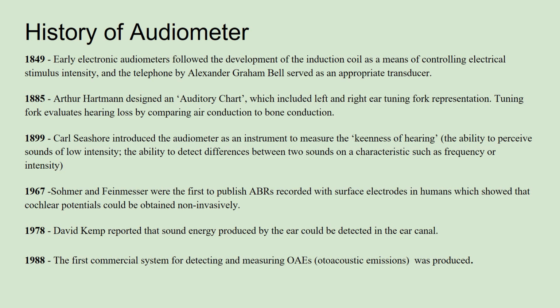In 1978, David Kemp reported that sound energy produced by the ear could be detected in the ear canal. And in 1988, the first commercial system for detecting and measuring otoacoustic emissions was produced.